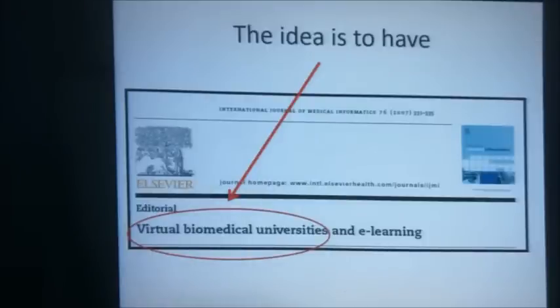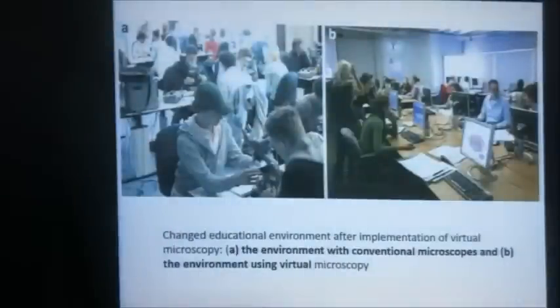You can study everything. You can even interact with teachers or tutors or lecturers online. So see the difference between the old-fashioned learning, which is using microscopes like these, where you have some of the slides broken, some of the slides missing.